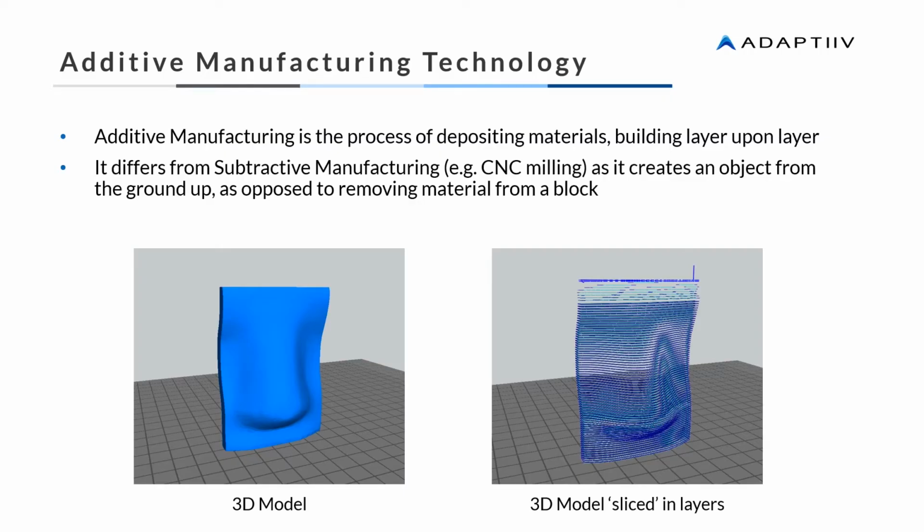So what is additive manufacturing and how does it relate to radiation oncology? The AM process has produced research advancements in many different industries, including medical applications. Well-known applications include patient-specific surgical models, implants and prosthetics, dental molds, tissue engineering, and of course, the fabrication of custom accessories for radiation therapy.